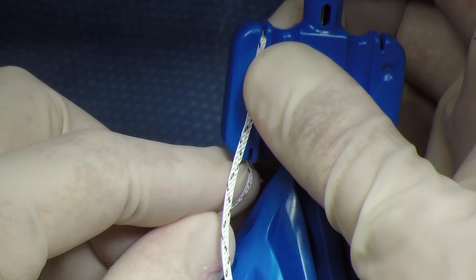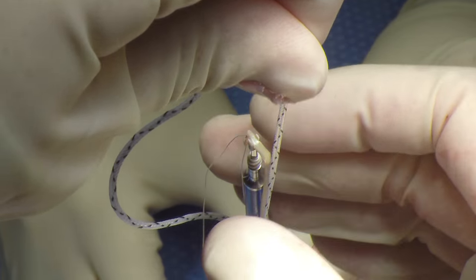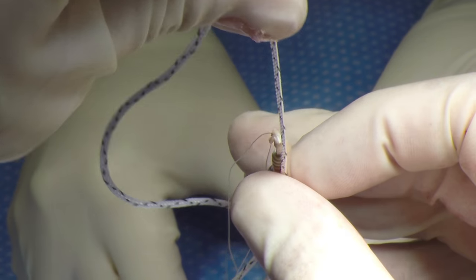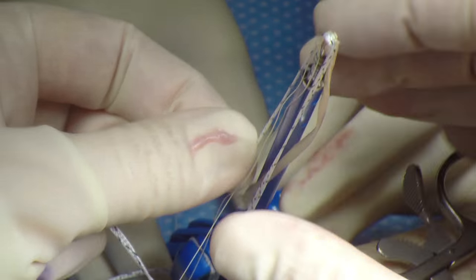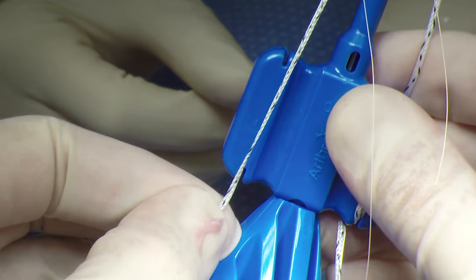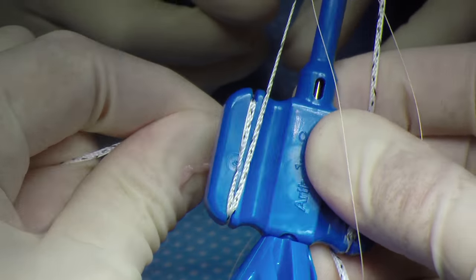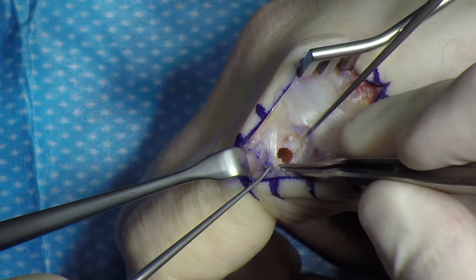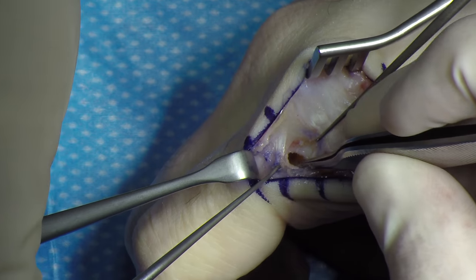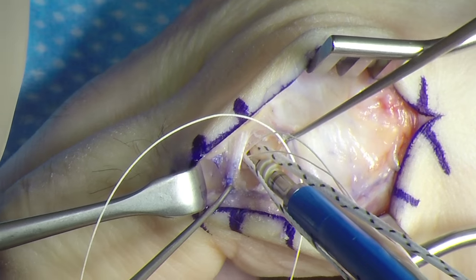The graft is then placed on an Arthrax 3.5 swivel lock suture anchor, as well as a labral tape that acts as an internal brace. You do have the option of using a suture tape, which is a little bit smaller than the labral tape. It's very important when inserting these anchors that there are no interposed soft tissues, as this can impair the passage of the graft and the anchor.